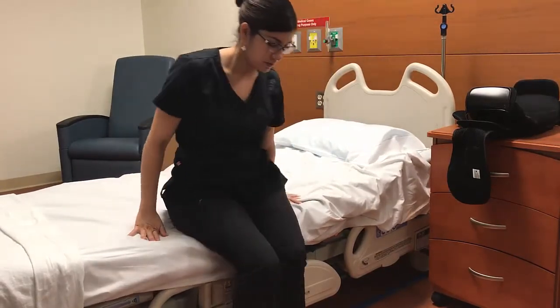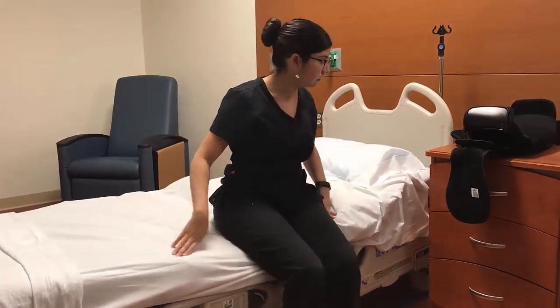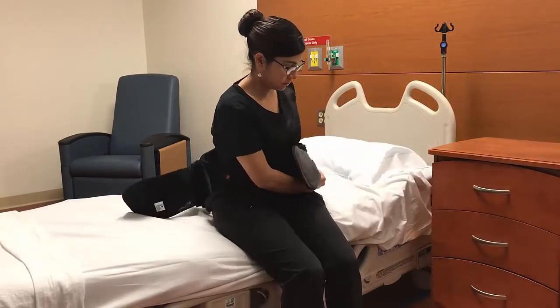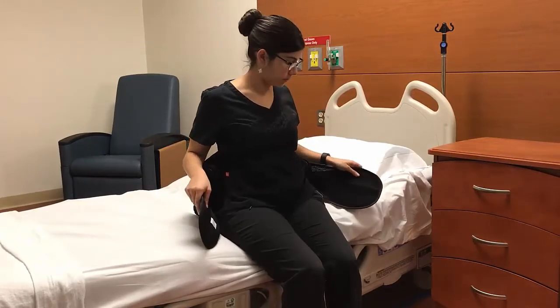The best place to keep your LSO is on your nightstand, so it's within reach and you don't have to bend or twist to get it. Sit with your feet flat on the floor and center the brace behind you, very low, almost touching the bed.